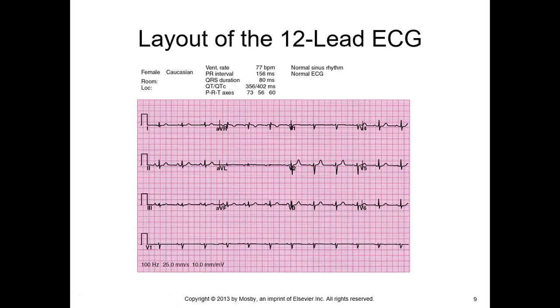So what is this all about? You can see that there is a patient here and it's giving you all the information. This is a standard strip. I do these in my office. You're going to learn this in the last 2 days of the class, I believe. We're going to go to the lab that week and practice. You're going to string up patients and we're going to do some EKGs on you guys, okay?